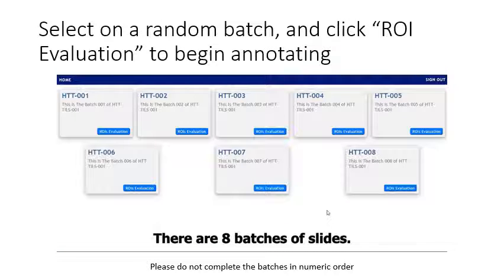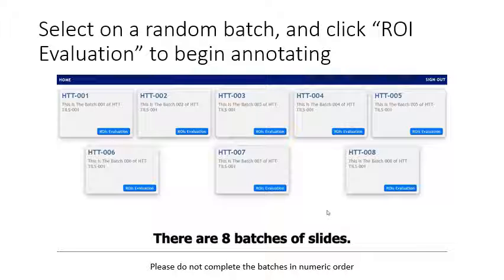You will then see a dashboard with different batches. Please do not complete batches in numeric order. Select one at random and begin evaluating.